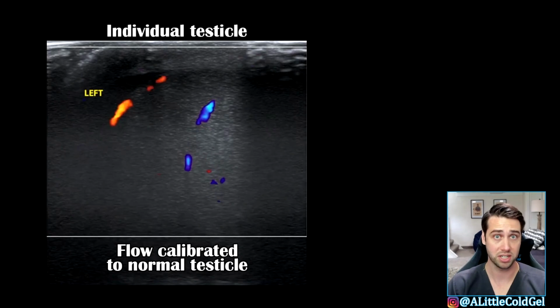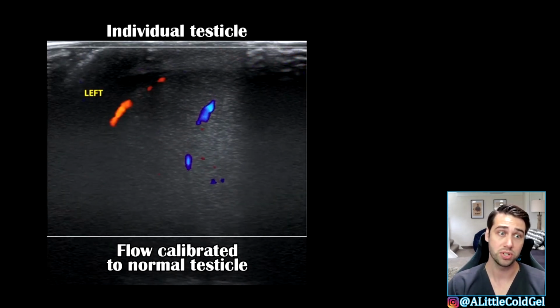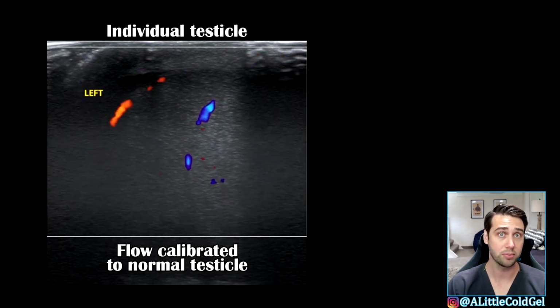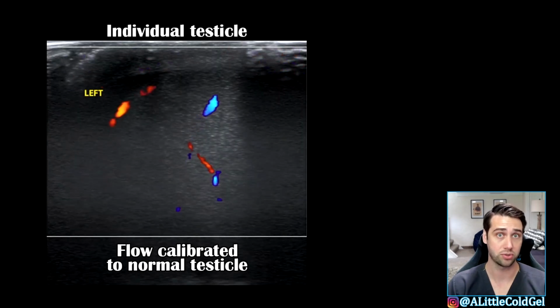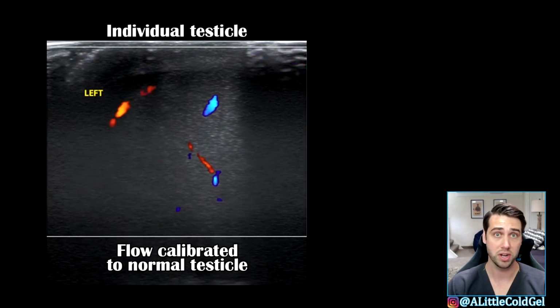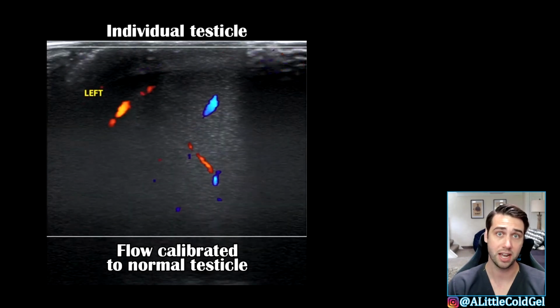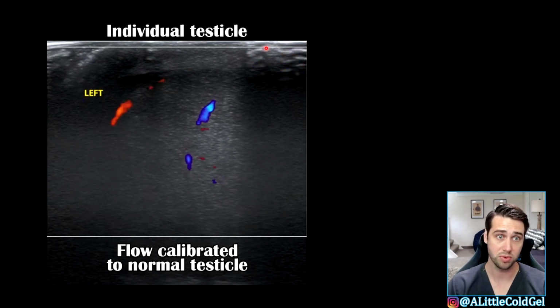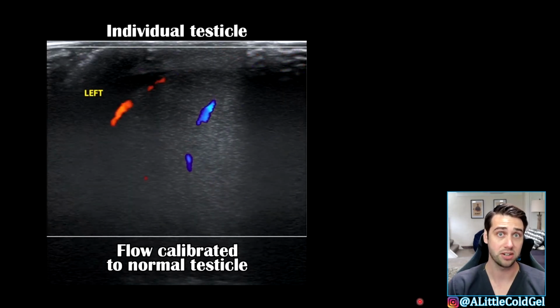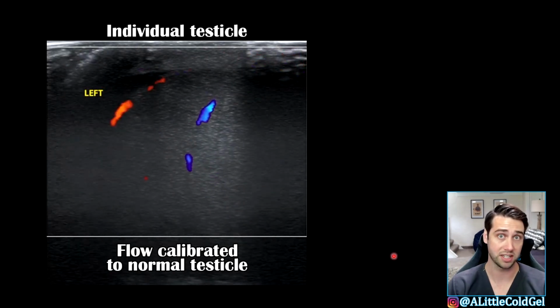So let's talk about evaluating the individual testicles. The key here is going to be color flow if you're looking for torsion, right? So let's say this was the normal testicle. What you do is you go over to that normal testicle, you put a color flow box on it, and you calibrate that color flow so that you don't have a lot of extra noise when you're looking at the testicle that is supposedly normal. So the way you change the color flow is to have the color flow box up and then adjust the gain. That adjusts how much color flow is on the image. So you can see when we move it, there's some noise up here at the beginning of this clip. And if you have too much color flow gain, your whole clip is going to look like that. But you can see within the testicle here, this is a good normal vascular appearing flow.